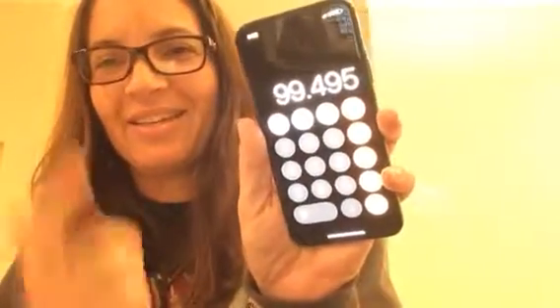So what that means to me is anytime I've walked out of the house without my blood sugar tester and I want to have an idea as to whether or not this is a good number, I can go into my Isig. Again, I go through status, sensor, Isig, and 18.09. And then I will just show you really quick, because a minute ago I thought I was beginning to crash, and now I'm feeling less like I'm crashing. So I'm checking to see whether or not that 134 even makes sense. So I'd go 18.09 times 5.5, and it's going to give me a 99 whatever.